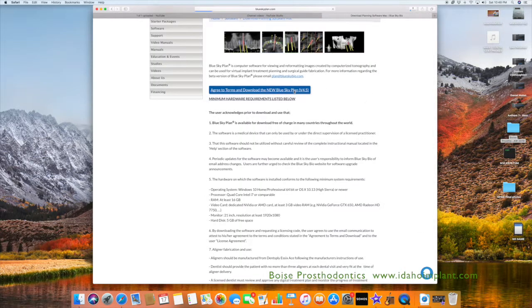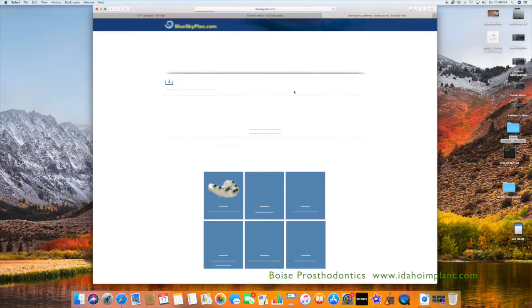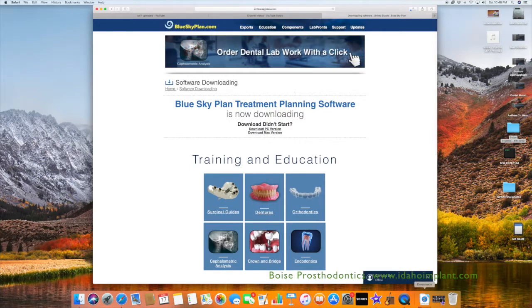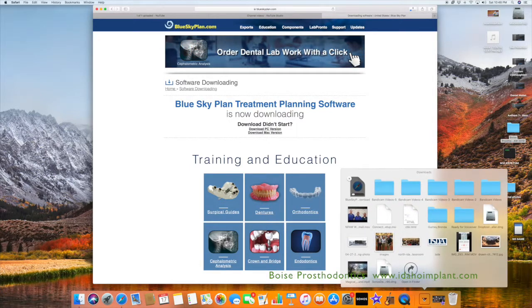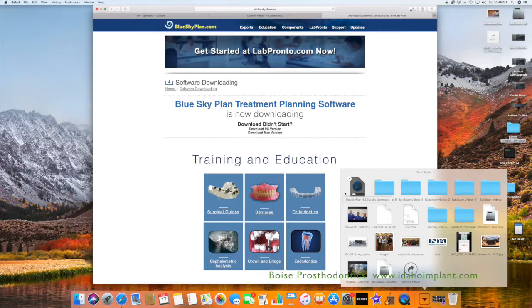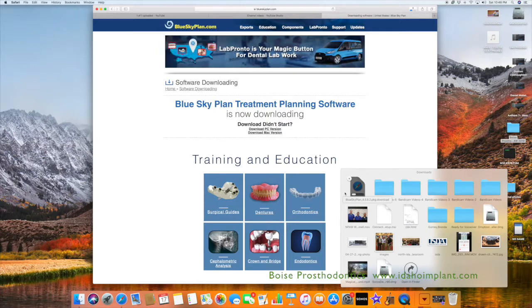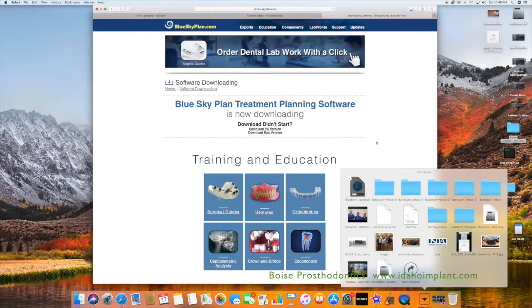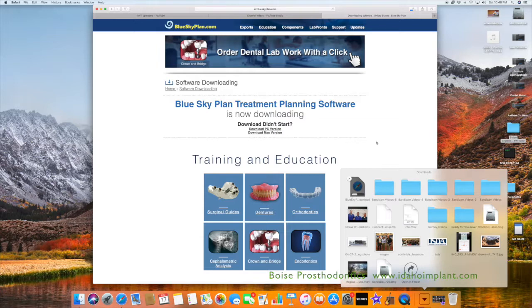It will then go down into your Downloads folder. As you can see, we'll open it and watch the download complete of the software. Once it is completed, you will then just double click on the icon and start the installation and activation process.